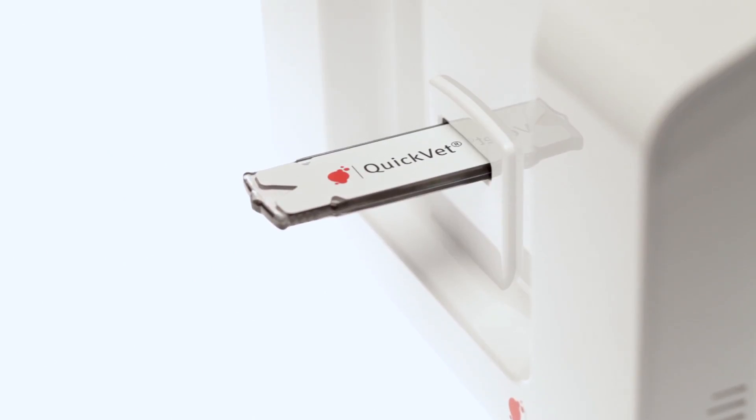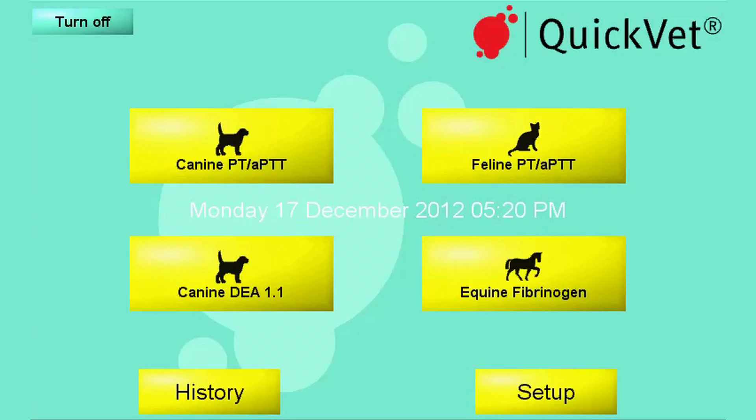You'll be asked to remove the sealing cartridge. As you remove the cartridge, you will be presented with four test options: coagulation, feline and canine blood typing, canine DEA 1.1, and fibrinogen for equine.